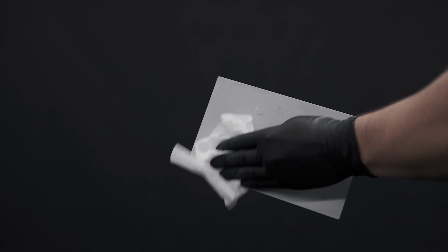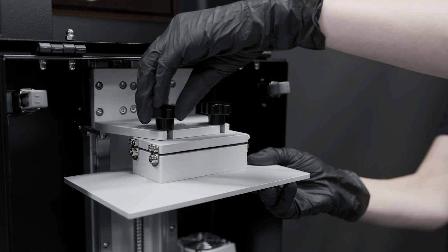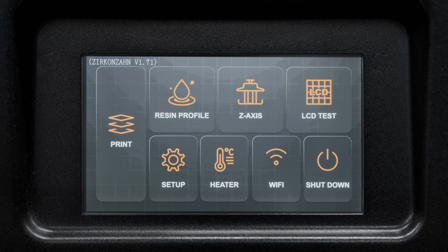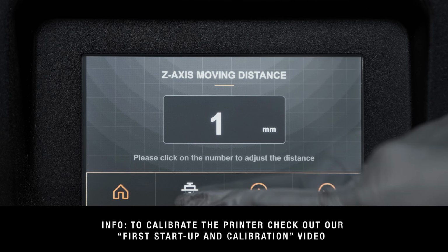Once finished, make sure the building plate is completely clean and place it back in the printer. Finally, perform a Z-axis calibration before the next printing process.